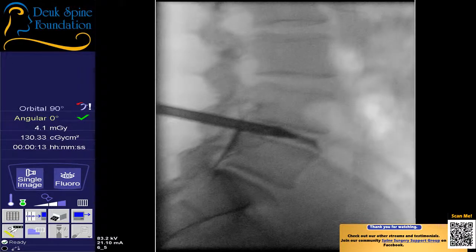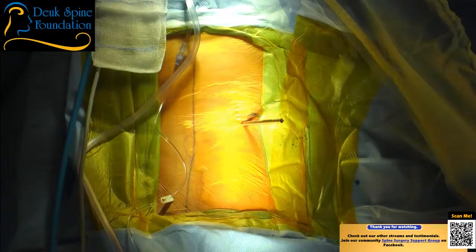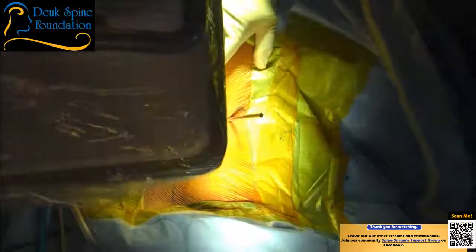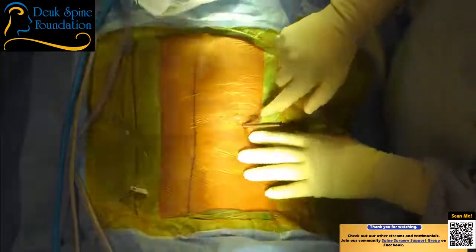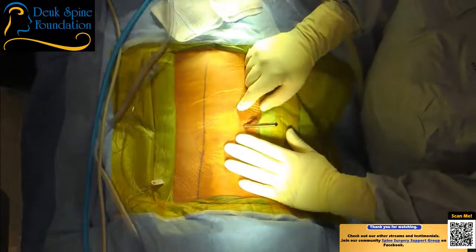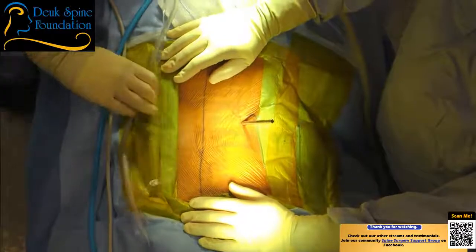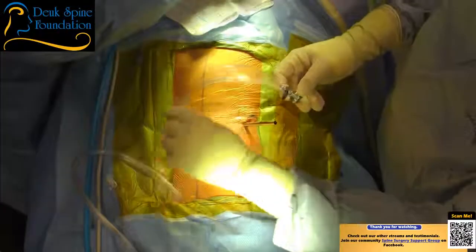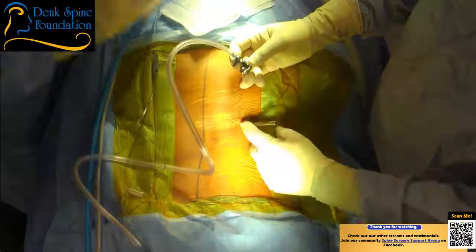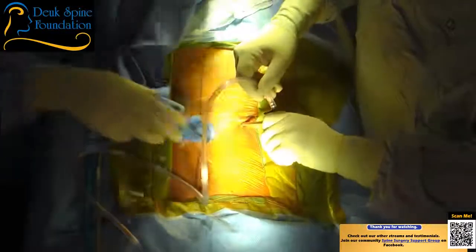We're actually going through a tear that's already there. We're in. The entire surgery is being done through this little tube — I call it the McDonald's shake straw. The Duke Laser Disc Repair is endoscopic surgery done with a single incision and a single tube. The tube is seven millimeters outer diameter — half the width of a dime.